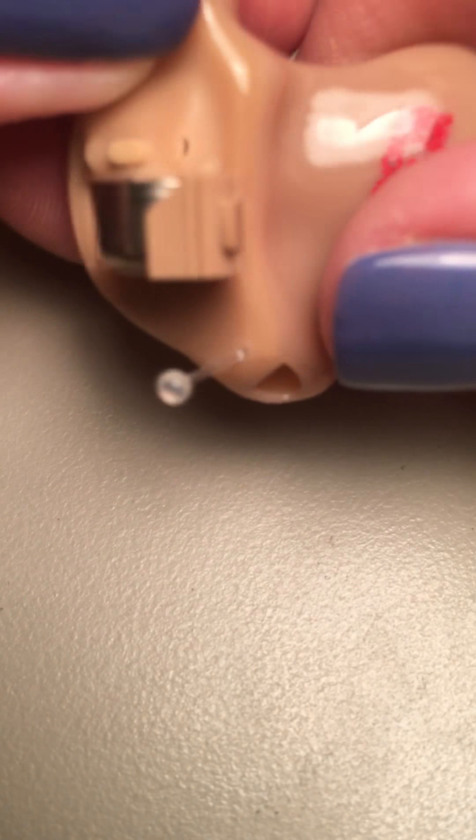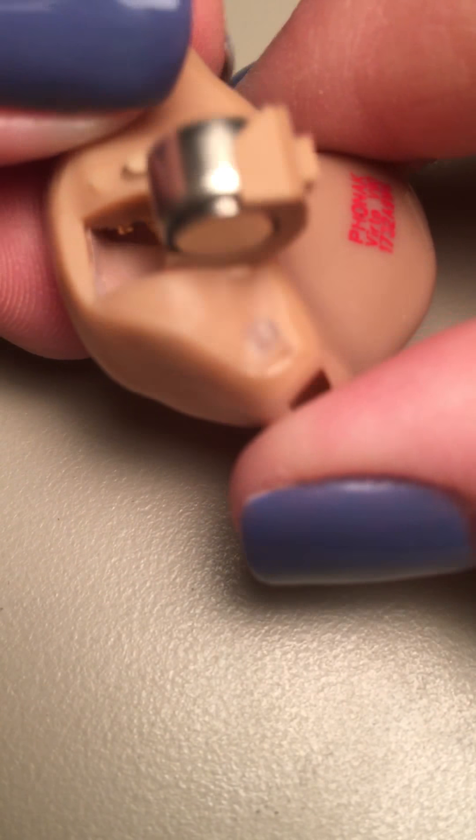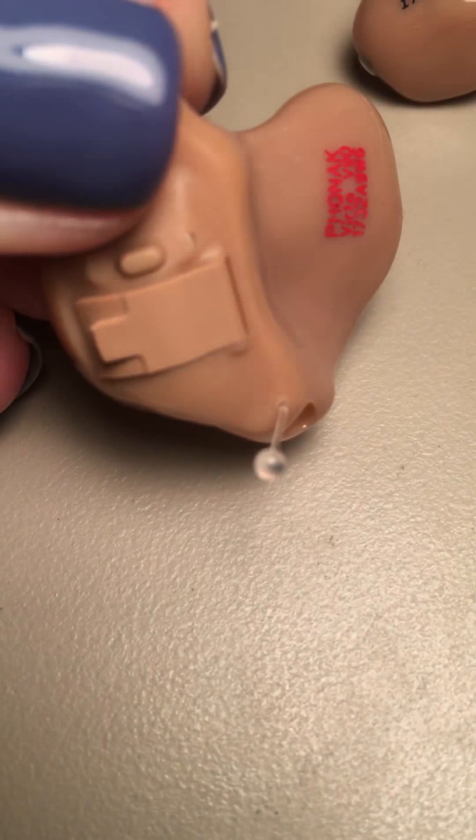You just put the battery straight in to the battery holder, and if you look at it, it sits in there nice and neatly — it's almost like a little cup holder in there. And when you shut the battery door, it should shut very, very easily.